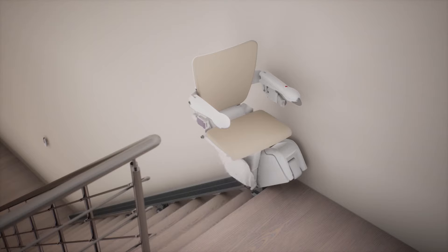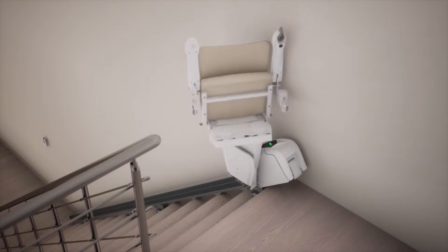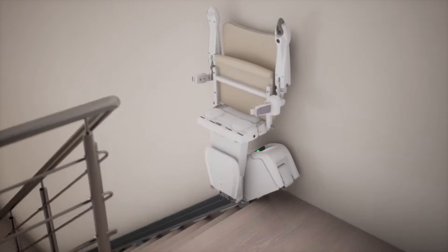To minimize intrusion for other stair users, the stairlift can be folded up. The Handicare 1100 — the slimmest straight stairlift on the market.